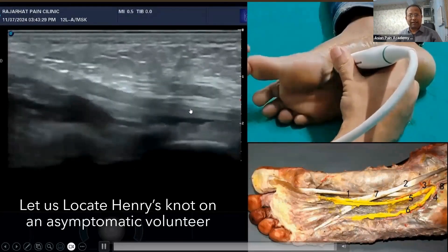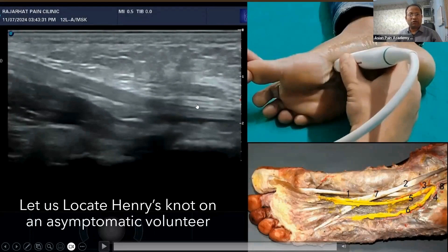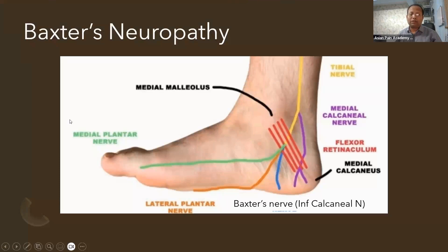Here is the flexor hallucis longus, and just above it is the flexor digitorum longus. This is the area of the Master Knot of Henry. If there is tendinitis, there will be fluid around the tendon.